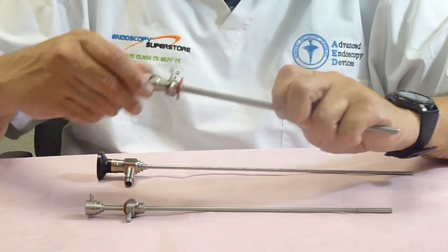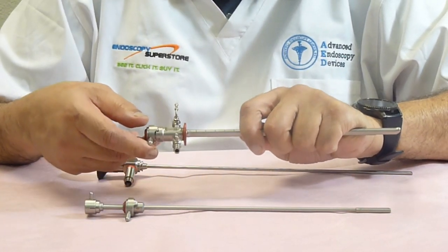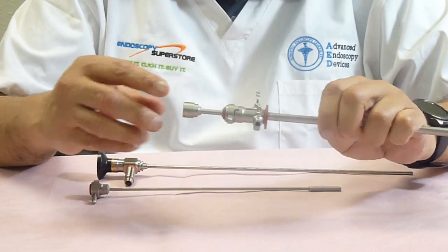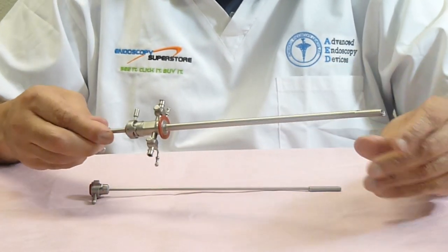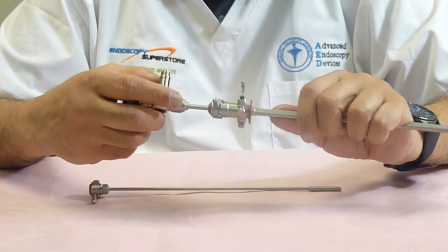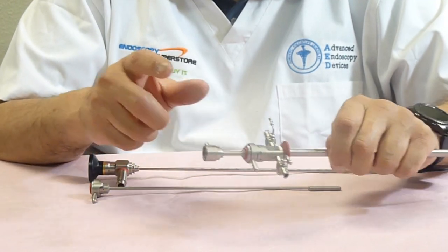Some doctors like to insert the sheath visually into the urethra and into the bladder — just in case patients have strictures or some sort of occlusion in the urethra. So we have what we refer to as a visual obturator. It allows you to put the scope in with the sheath, and it has an atraumatic tip so doctors can pass through the urethra into the bladder without traumatizing it at all. All our visual obturators are color-coded to match the sheaths — this one is color-coded to match the 20 French sheath.